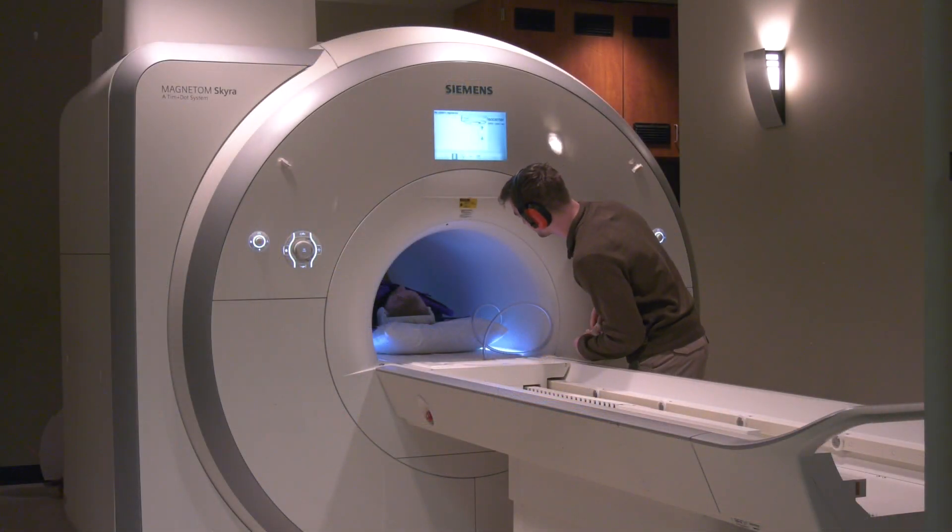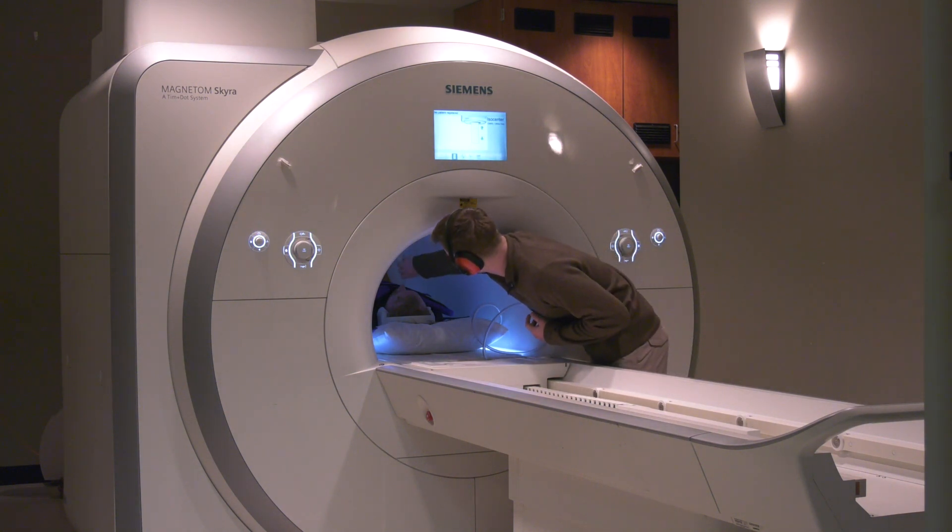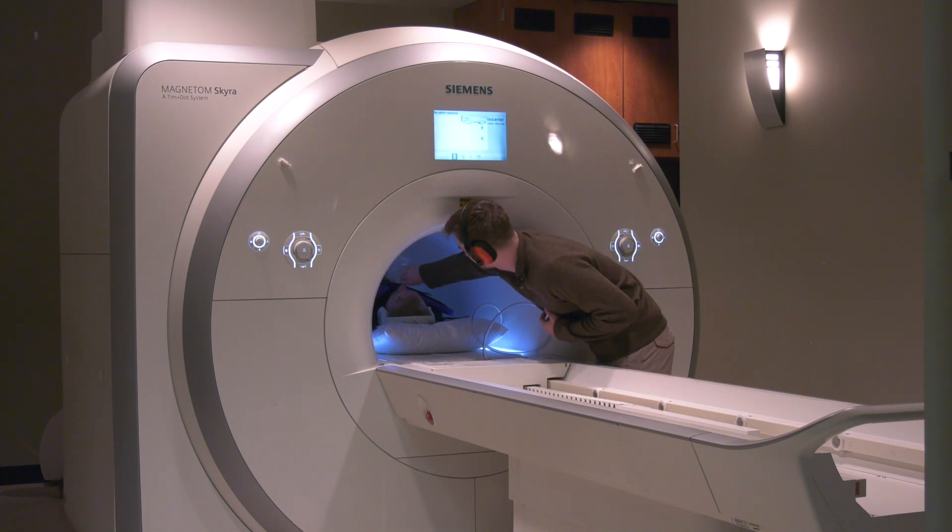The length of the breath hold for imaging depends on the type of pictures being taken. Typically, the breath hold is between 5 and 10 seconds, but for some pictures it takes up to 15 seconds. The Xenon MRI session often includes multiple breath holds to collect different types of Xenon MRI pictures.